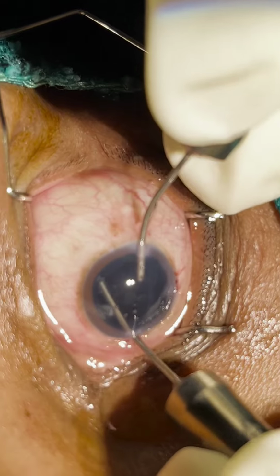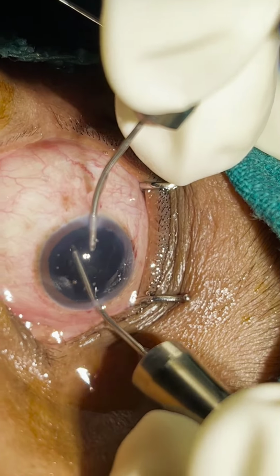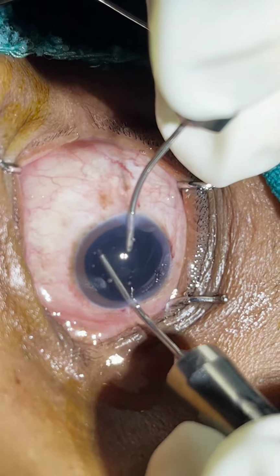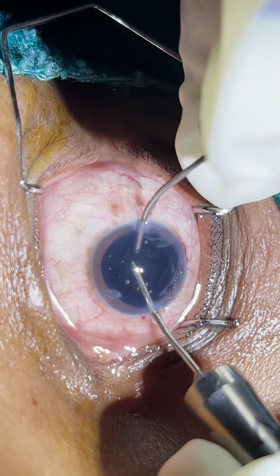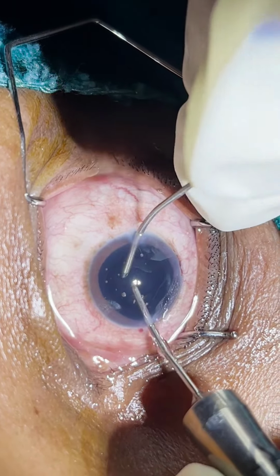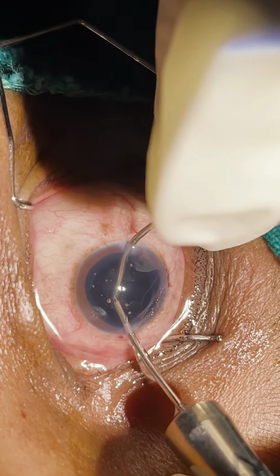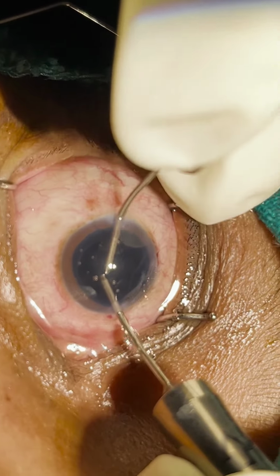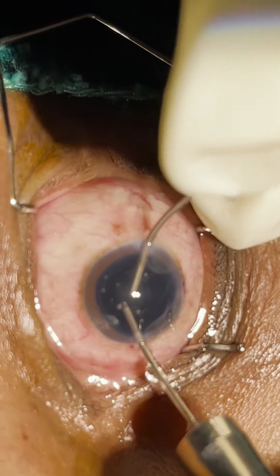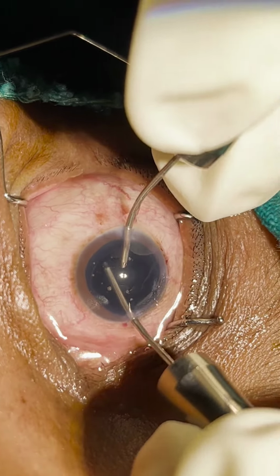It was a case of PSCC, so lots of lens matter and cortical matter are stuck to the PC. So now what I am doing is a PC polishing so that those small particles come out. We must do the PC polishing, because if we don't, it will go for PCO formation very early.